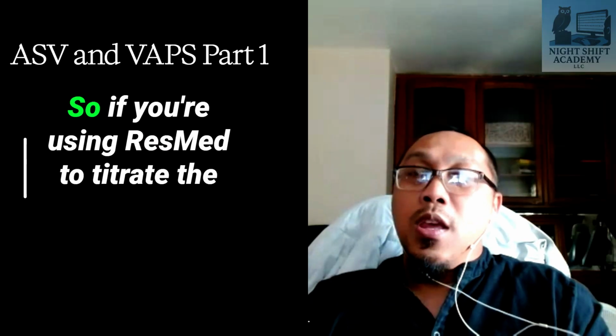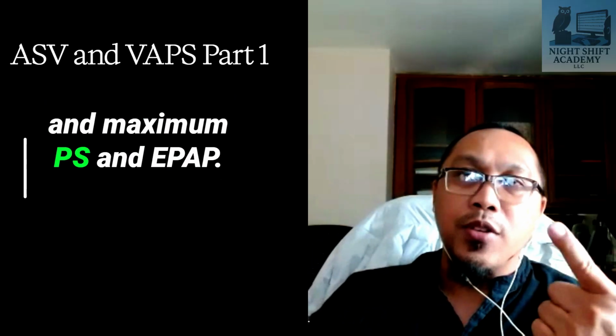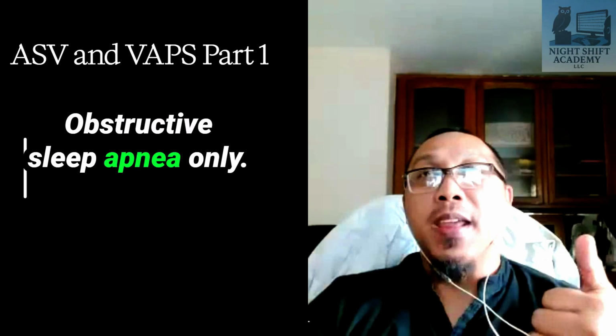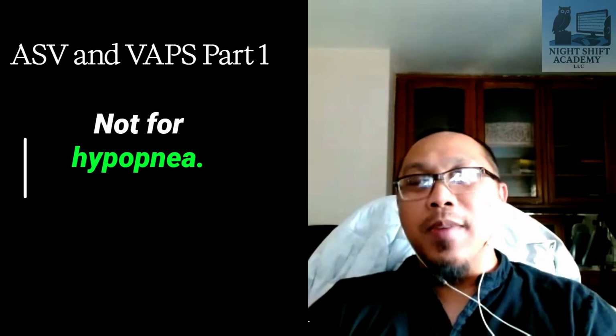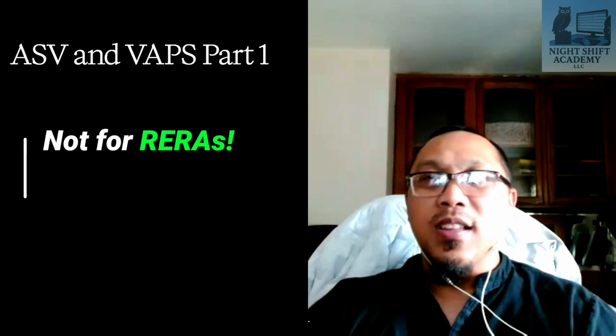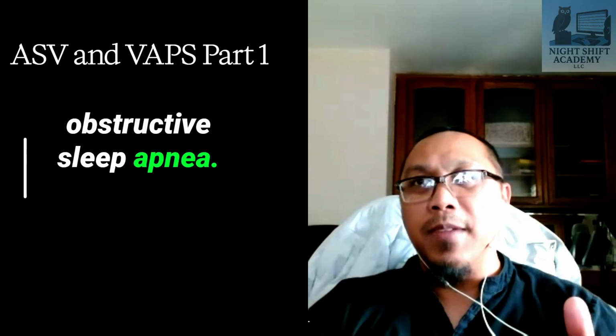Okay. So if you're using ResMed to titrate the patient on ASV, you will only set the minimum and maximum pressure support and EPAP. As a tech, you will increase EPAP for what type of events? Yes, obstructive sleep apnea only. Not for snoring, not for desaturation, not for hypopneas. And if you're calling RERAs, not for RERAs. You will only increase EPAP if it's an obstructive sleep apnea.